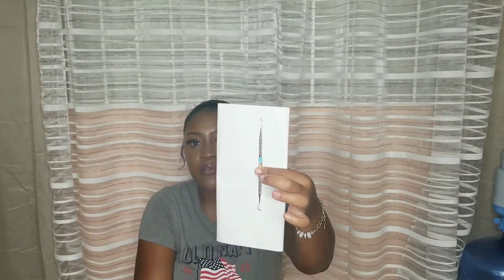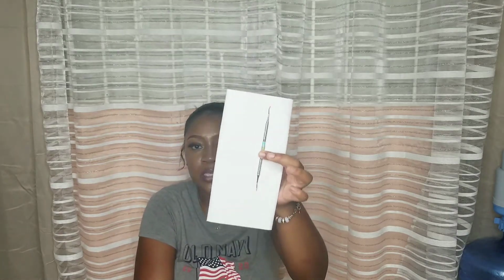And you do have some instruments that come with both. So for this one, it has a Gingival Marginal Trimmer on one end and a hatchet on the next. I'm going to try and insert pictures so that you guys can see better.